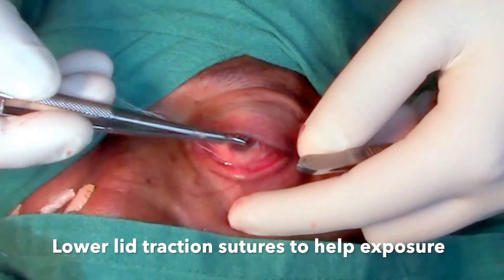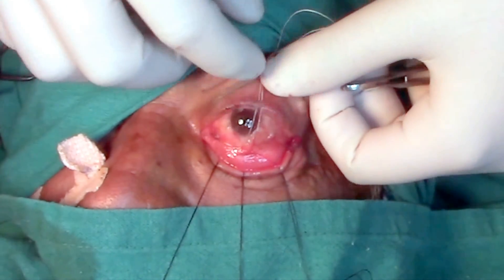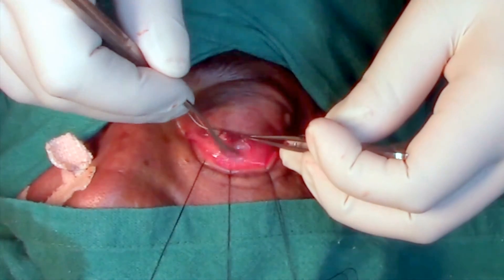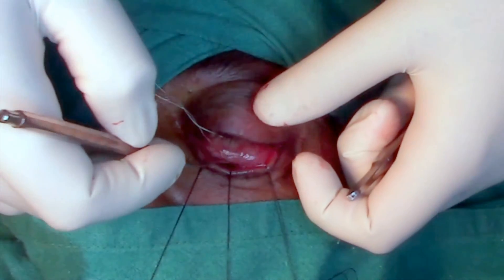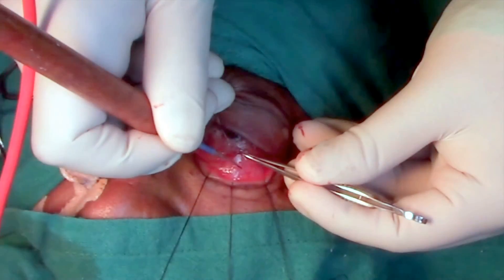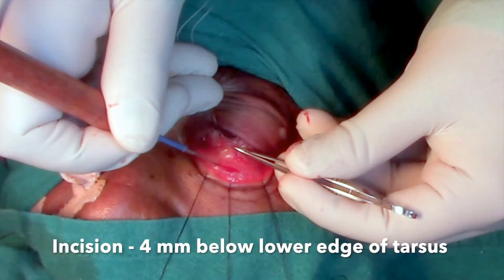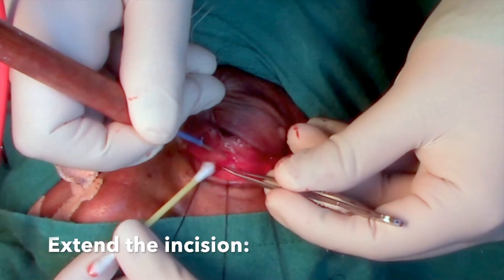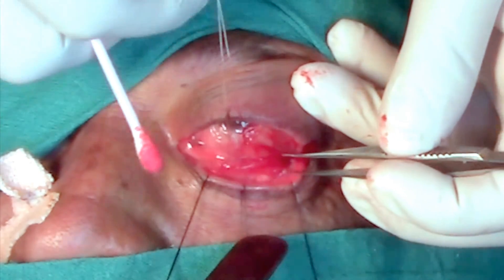Pre-placed lower lid traction sutures can also help in increasing the exposure and the axis. Palpate the orbital rim once before making the incision, so you have an idea of the direction of the incision. Just below the lower edge of the tarsus, about 4 mm, initiate the incision. I prefer to use a radiofrequency cautery, which also coagulates as it cuts.